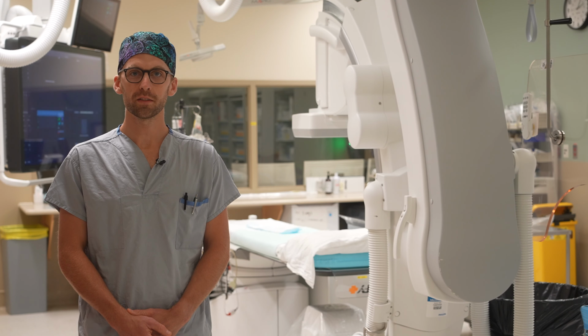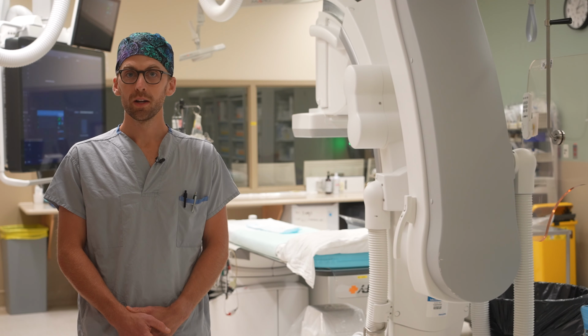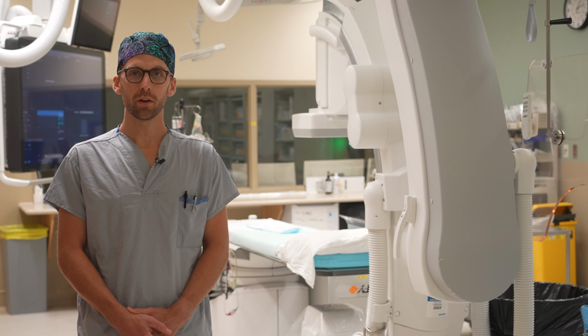If the cardiologist decides that balloons or stents are a good option for you, they will let you know when this procedure, called an angioplasty, should happen. If you are waiting for your procedure in hospital, it is likely the cardiologist will insert balloons or stents during your angiogram. However, if you have come in from home, the cardiologist may send you home to start you on medications required for an angioplasty, before having you return for the procedure.